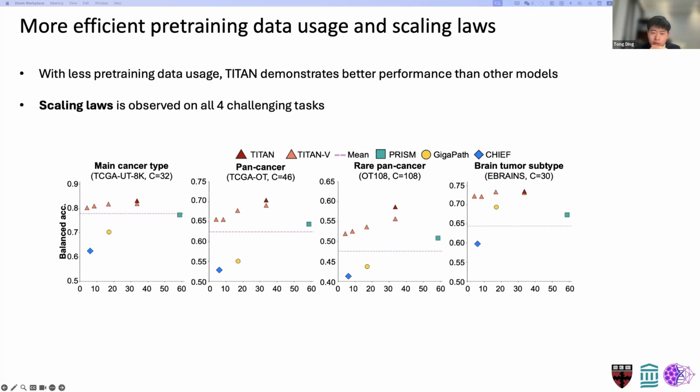I actually don't think so, because I think the training at slide level is easier than the training at patch level, where we need to process the raw pixels. Here in the feature space, especially when you have a very strong patch level encoder, the training is actually getting easier.